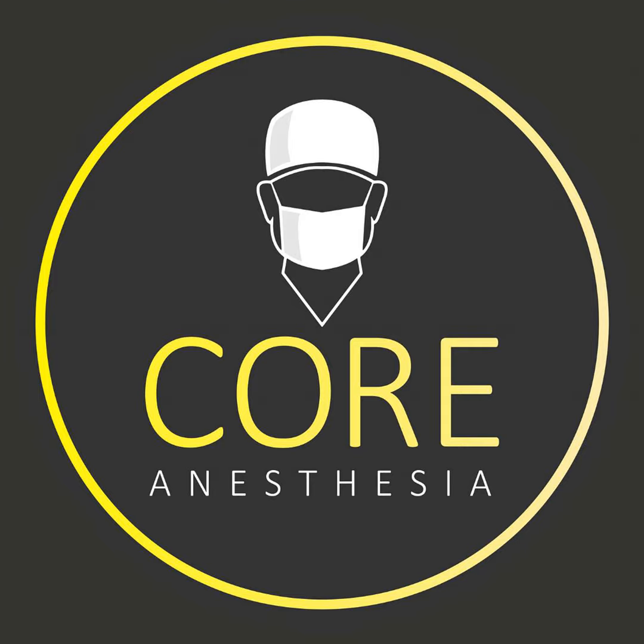You can pick up on increases in your CO2. Maybe you have a hypermetabolic state, or you have sepsis, MH, you have more pain, a tourniquet has been deflated. All these different things you can start to see on your end tidal CO2. And just keep in mind that the end tidal CO2 is just that, your end tidal CO2. If you remember pressure gradients and how things go from in the bloodstream to in the lungs or vice versa, remember that there's pressure gradients needed there. And so you need to have a higher pressure in the blood for the CO2 to cross back into the lungs and then be expired.